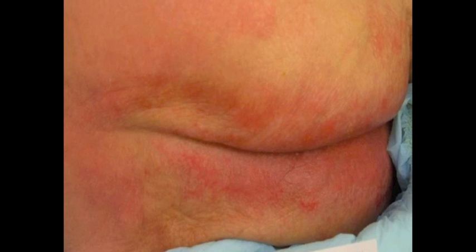You notice his skin is becoming irritated and red on his sacrum. When you are filling in his Braden scale, you determine that he is a 2 under the moisture category, as his skin is often but not always moist and his linen must be changed at least once per shift. When we refer to the guidelines, some of the examples for interventions for a patient scoring a 2 are as follows.